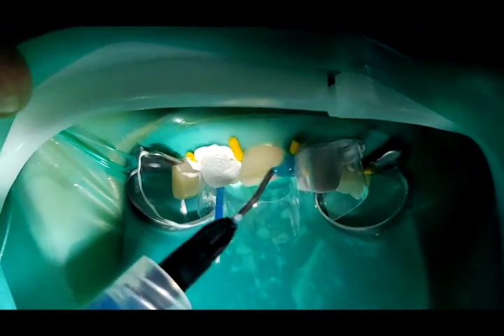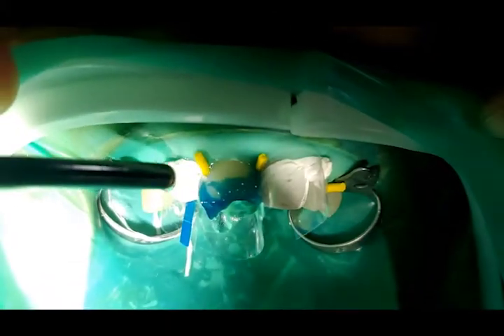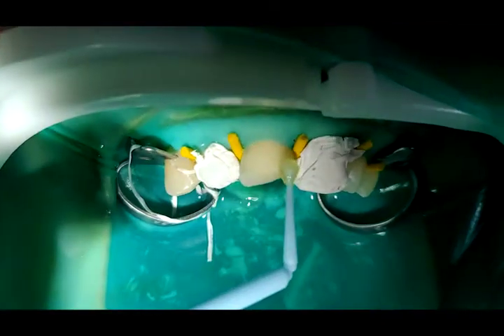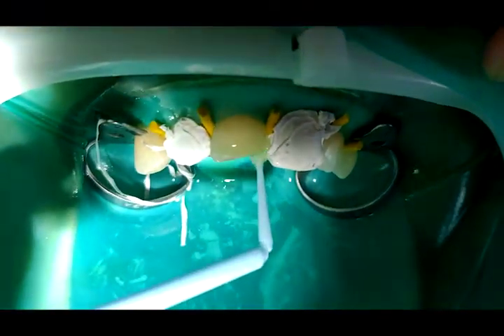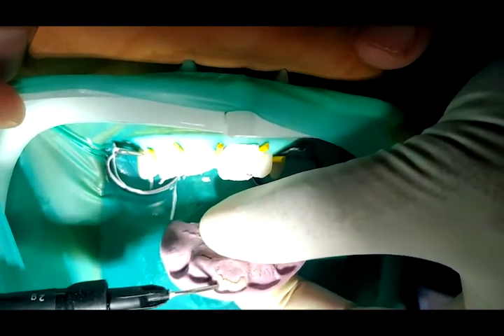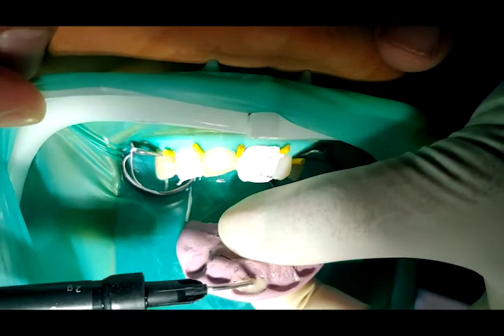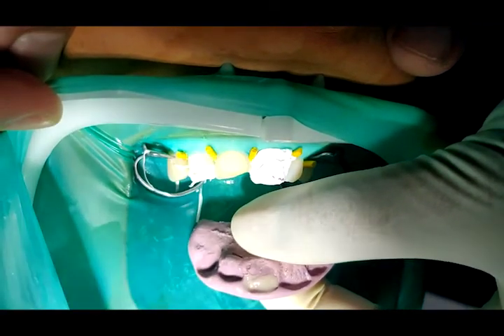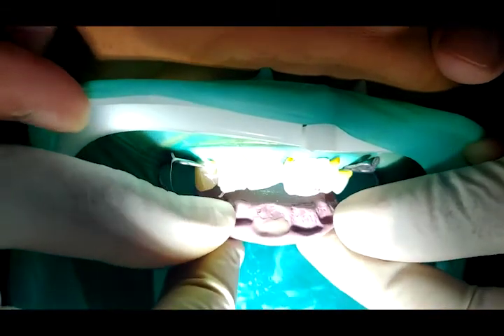Etching of the tooth surfaces was done, followed by rinsing and drying. Universal bonding agent was applied, followed by curing using an LED curing unit. The palatal shelf is created using the putty index, followed by placing the index, adapting the composite, and placing a sectional matrix to build the proximal wall.